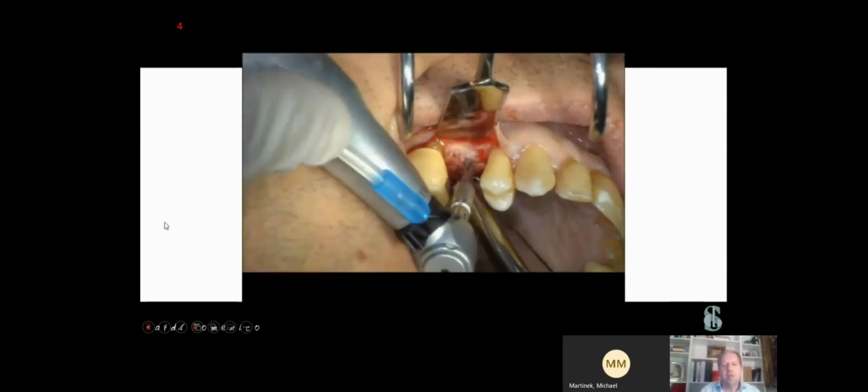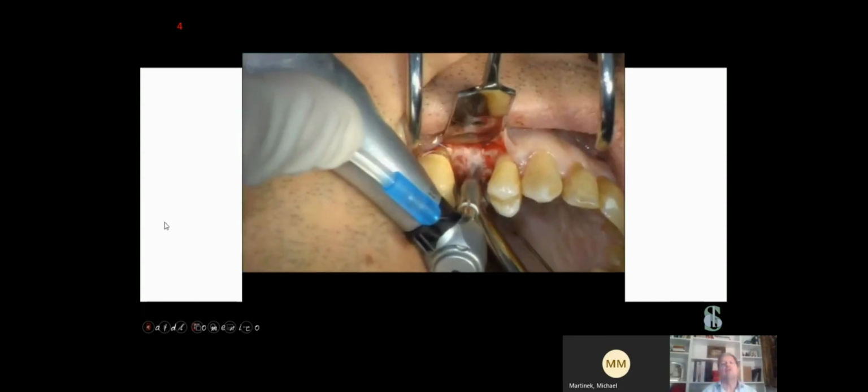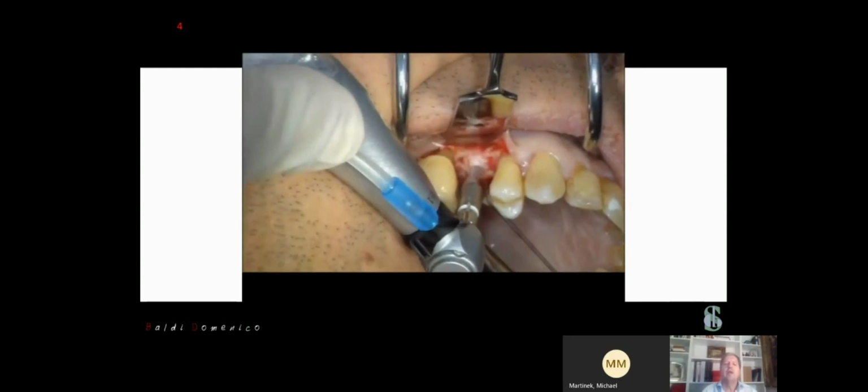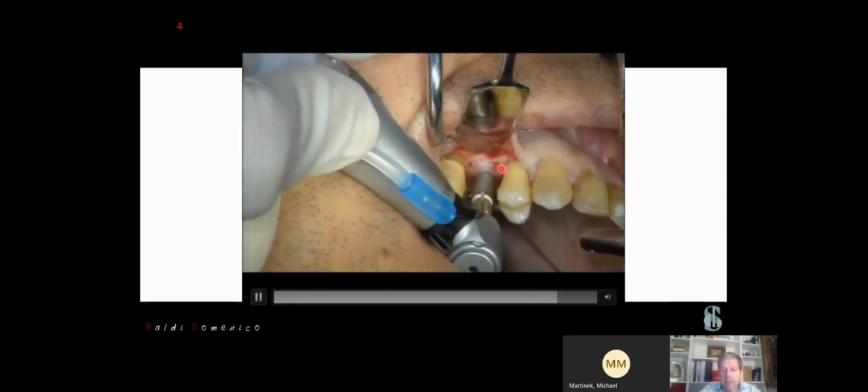Of course, if you want to, you can work directly with the bur. You can arrive at 1 millimeter, 1.5 millimeter near the internal cortical bone. But look how difficult it is to manage this situation, and how full of risk it is, because we are working in a blind way.